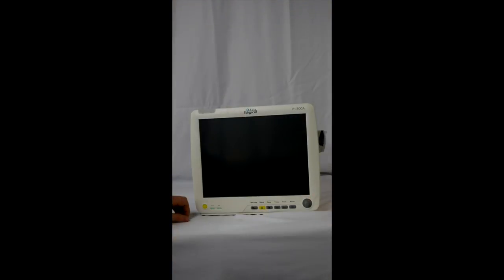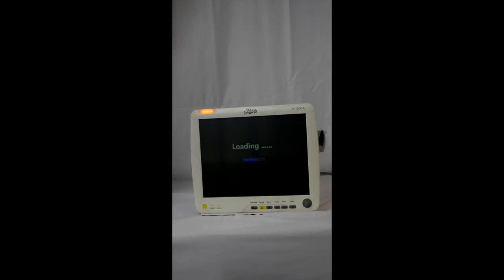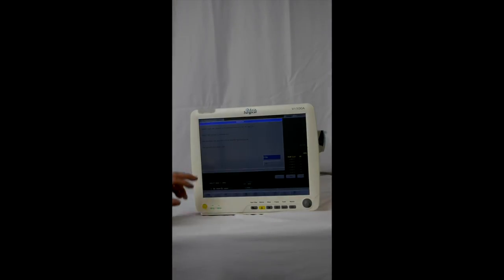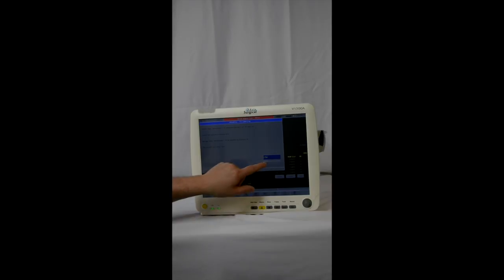To start out, you want to turn the machine on by pressing and holding the yellow power button in the left corner. After it loads, you can just hit the no button.